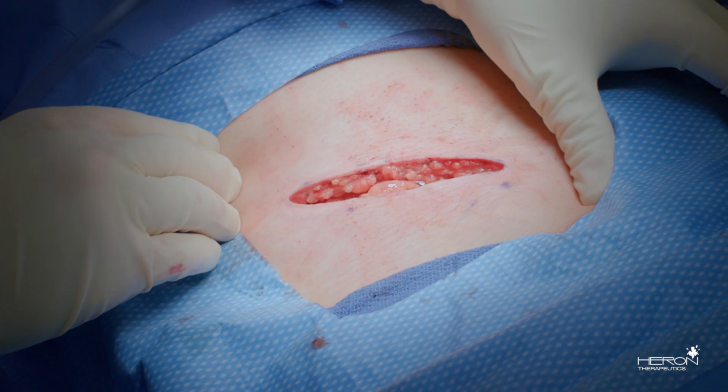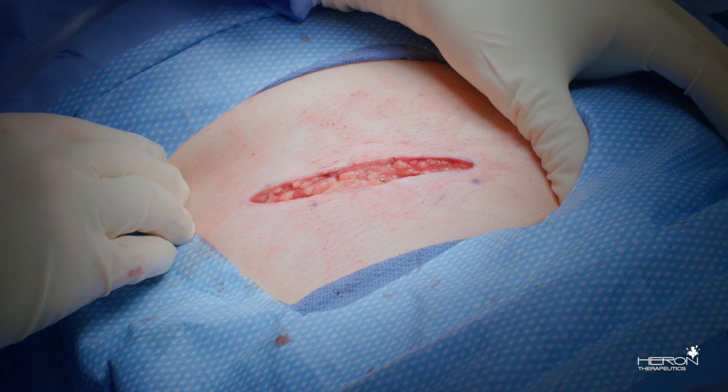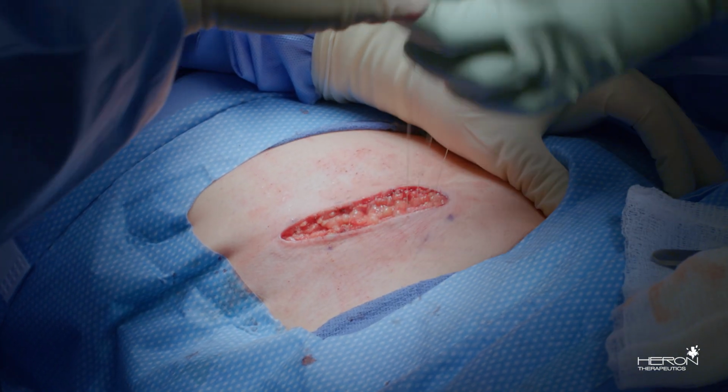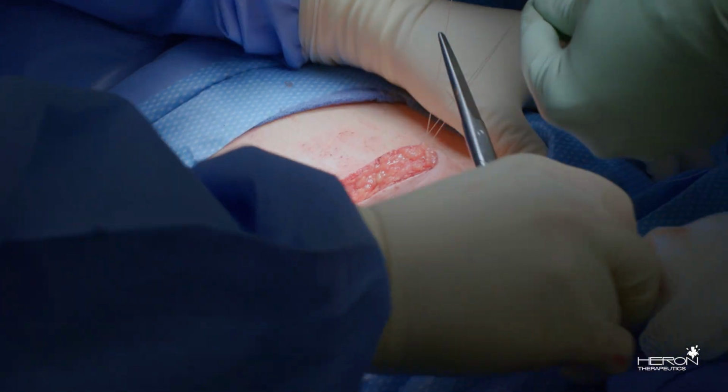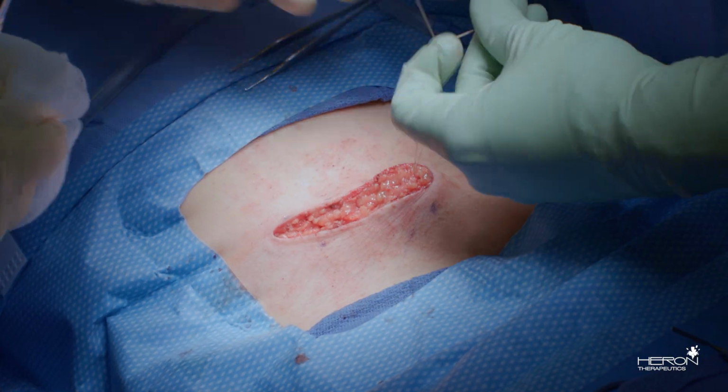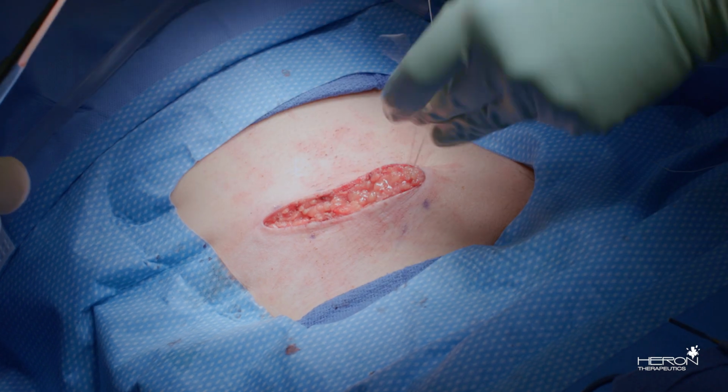After placement anterior to the external oblique aponeurosis, closure of Scarpa's fascia then isolates the product from the final skin closure. The surgeon then removes the outer gloves so that the gloves and the instruments are clean for the standard skin closure and dressing. Application of the product is generally pretty straightforward.